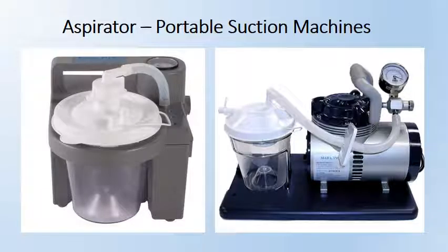Aspirators are portable suction machines that can be used to remove secretions such as mucus and saliva that may be obstructing the airway, as well as small obstructions. They do have in common applications for removing blood during surgery and other multiple applications of a portable suction machine.